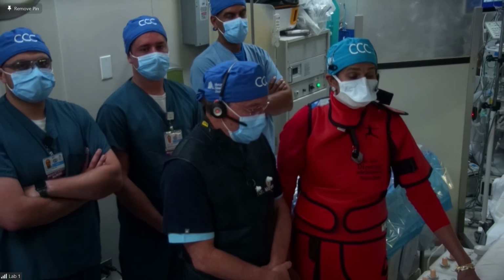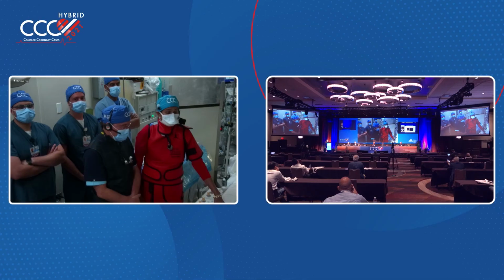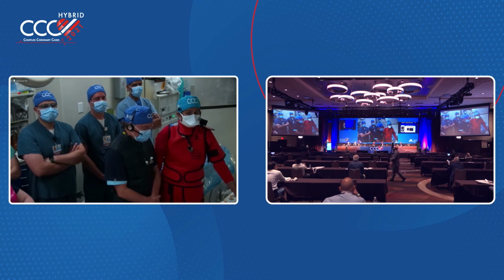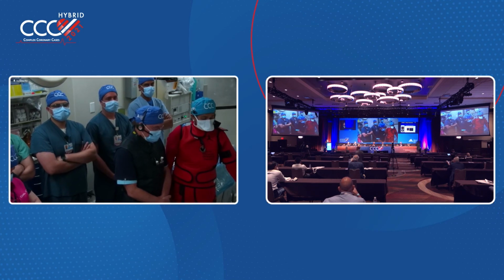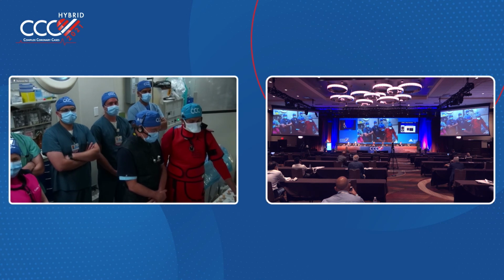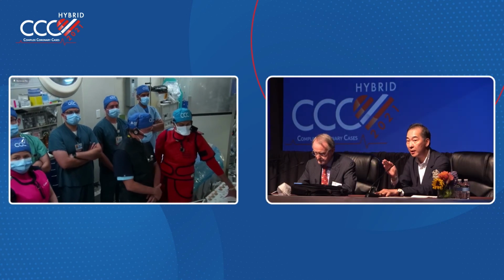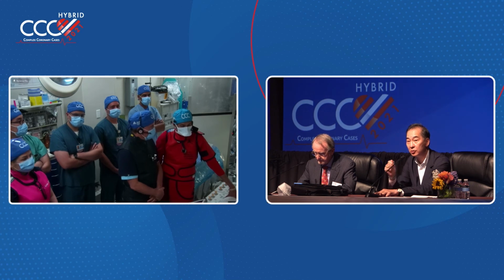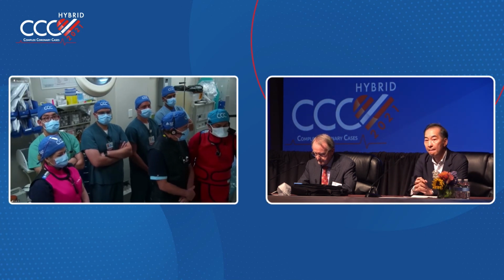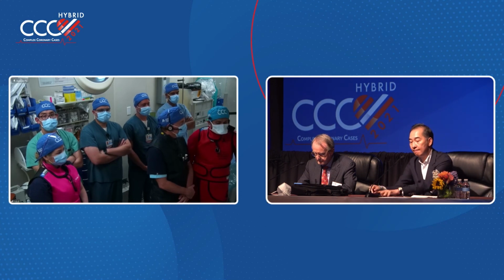Yes. This is a nice case. Dr. Kini, Dr. Moreno, congratulations. The reason the 1.25 balloon cannot cross the side branch, do you try to rewire the Y first, or you just go into the anchor balloon technique? We rewired. We rewired twice.